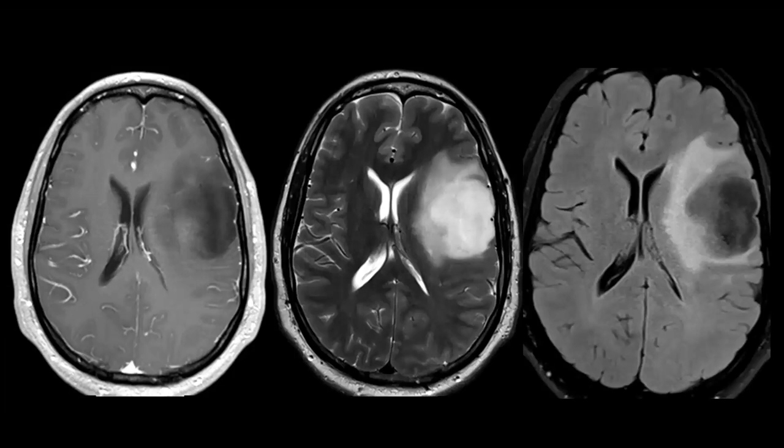Yeah, I think it goes along the lines now with much more confidence that it is going to be an IDH mutant astrocytoma. Absolutely. Look, if you didn't know before, when you saw this, it is a huge red flag against IDH wild type disease. The intravascular fibrin microthrombi, which were very real and very present in this case, notwithstanding, there are always exceptions. You cannot base, or should not base, your diagnosis solely on one data sphere. That's the whole point of the 8 data sphere model.